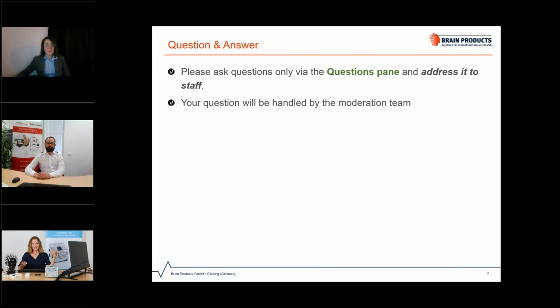In that case, you would need to start a different analysis project, not a screen-based eye tracker project, but an external presenter project, and there you can import data that was recorded with E Prime. Okay, perfect. Thank you so much.